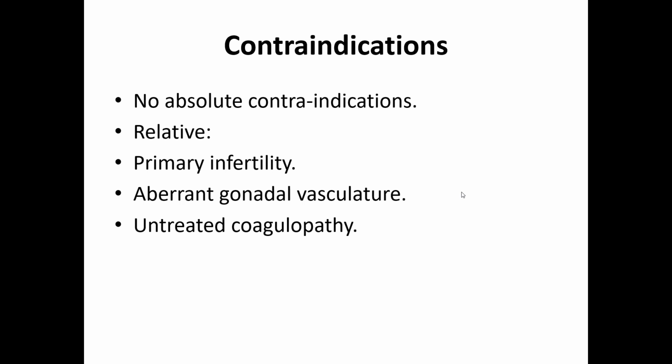The contraindications of this procedure are relatively primary infertility, aberrant gonadal vasculature, and untreated coagulopathy. Certain types of primary infertility. We are not going to embolize all types.